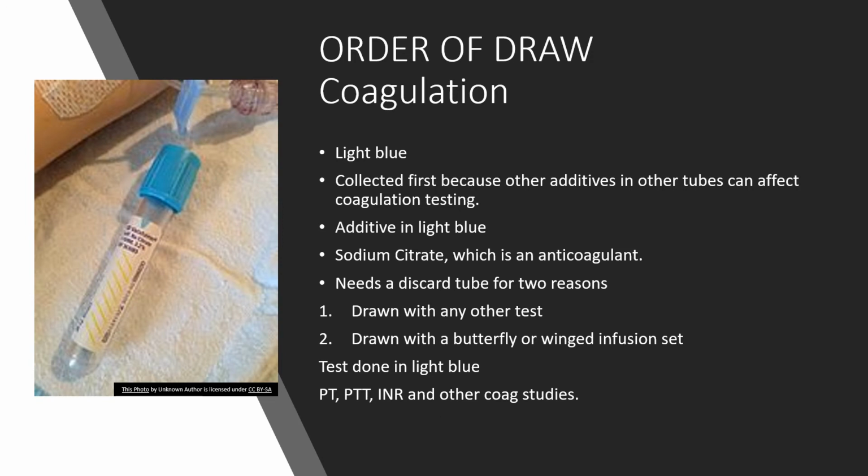So some things you need to remember with the blue top tube: like I told you, there is a strict ratio of the sodium citrate to the amount of blood that should be in the tube. We want the proper mixture of the blood to the anticoagulant. It's very, very important when you're talking about coagulation studies. So we always want to make sure that this tube is drawn properly. It's drawn first, and it is drawn 100% full, okay?